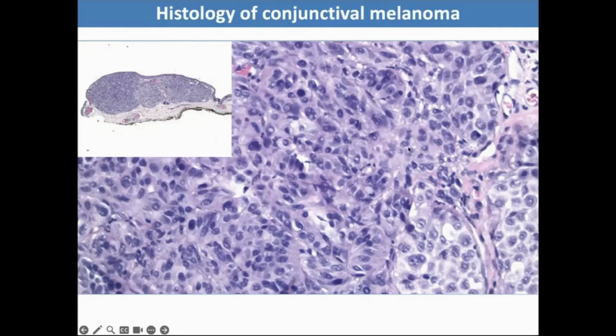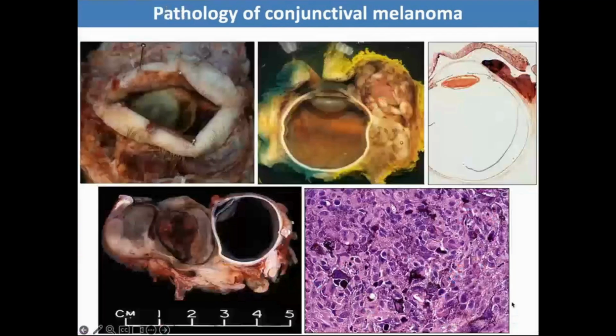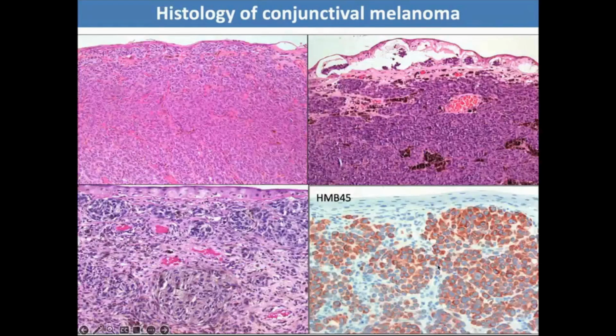They too are a bit like sebaceous carcinomas in that they can be multicentric. They can occur with invasive nests of melanocytes. They typically invade lymph vessels and also capillaries. And in contrast to nevi, you have this homogeneous staining of HMB45 and obviously also of the other melanocytic markers such as Melan-A and SOX10.